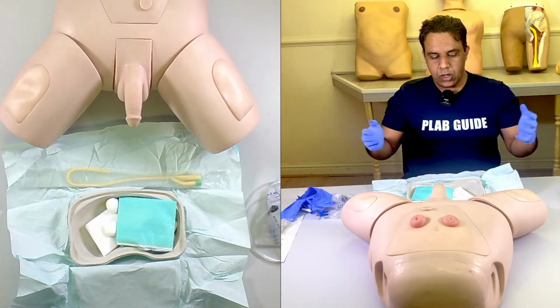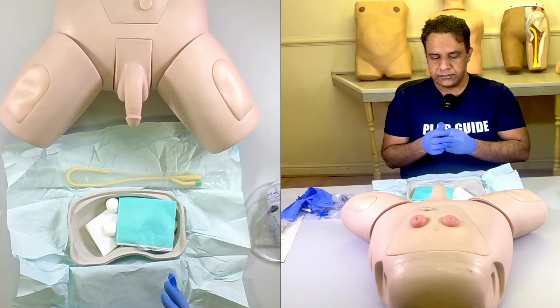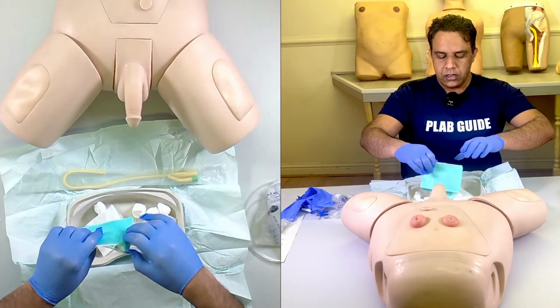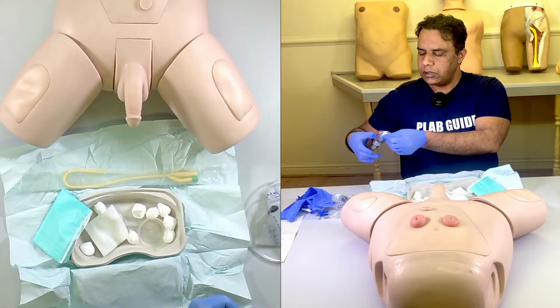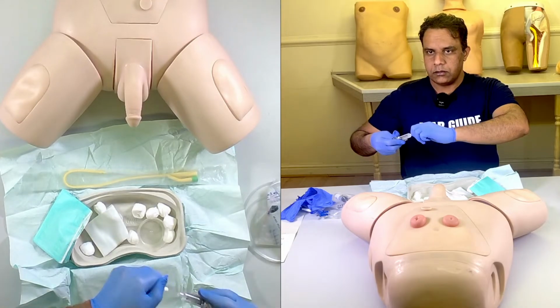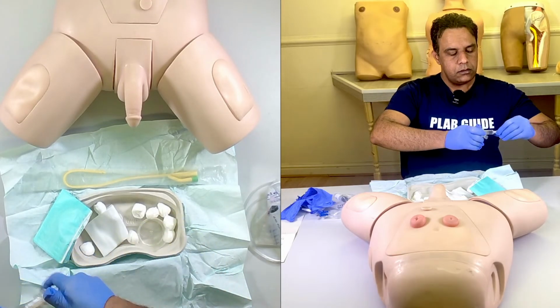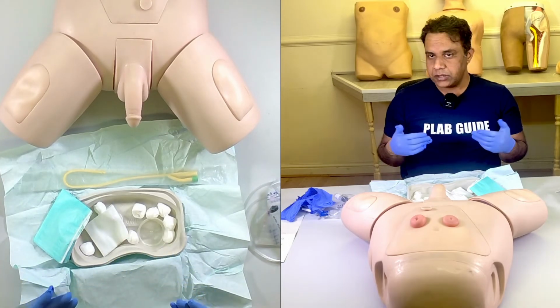Okay, so now we are ready. Wearing my sterile gloves, I need to get access. The patient is prepared, ready to have the catheter. This is the port for the solution to clean. In your examination, you may get just an empty pot labeled with the sterile water to clean.